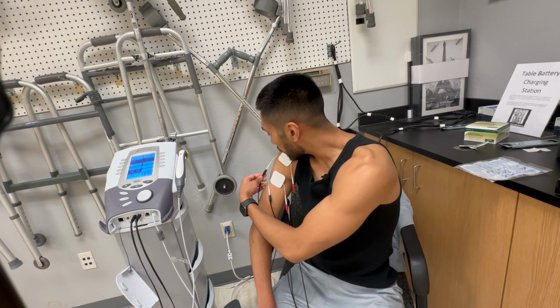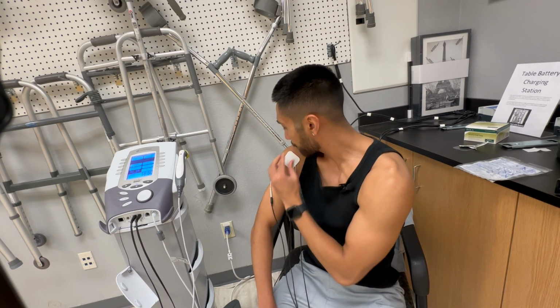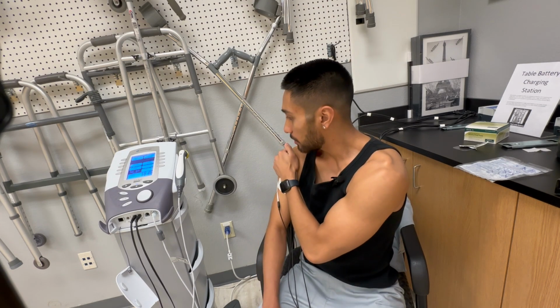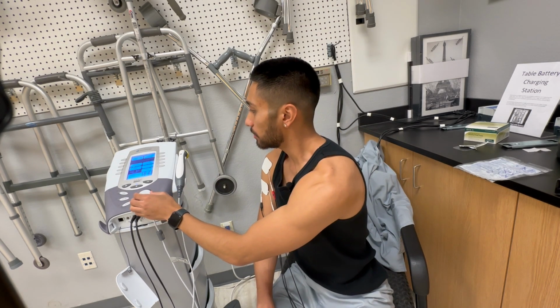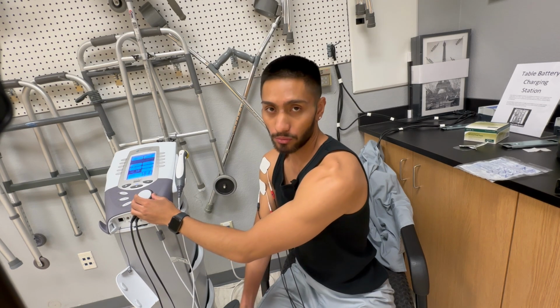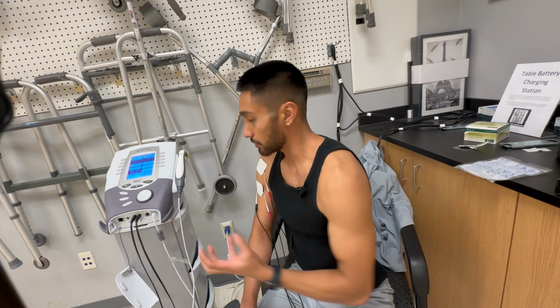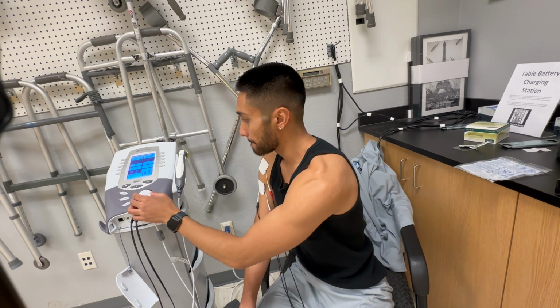And let's make sure the pads are connected. I'm just not feeling anything, and this is why having the dial to switch around to where we feel different intensities and different feelings is important.